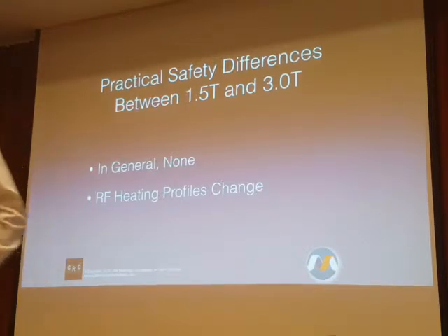The MR conditional devices today, they have done amazing engineering to reduce the likelihood, even if the length is that perfect length. They've done all kinds of amazing things with the cable, the lead configuration, the material, the construction of it, that reduce the likelihood of heating for these MR conditional implants and devices.